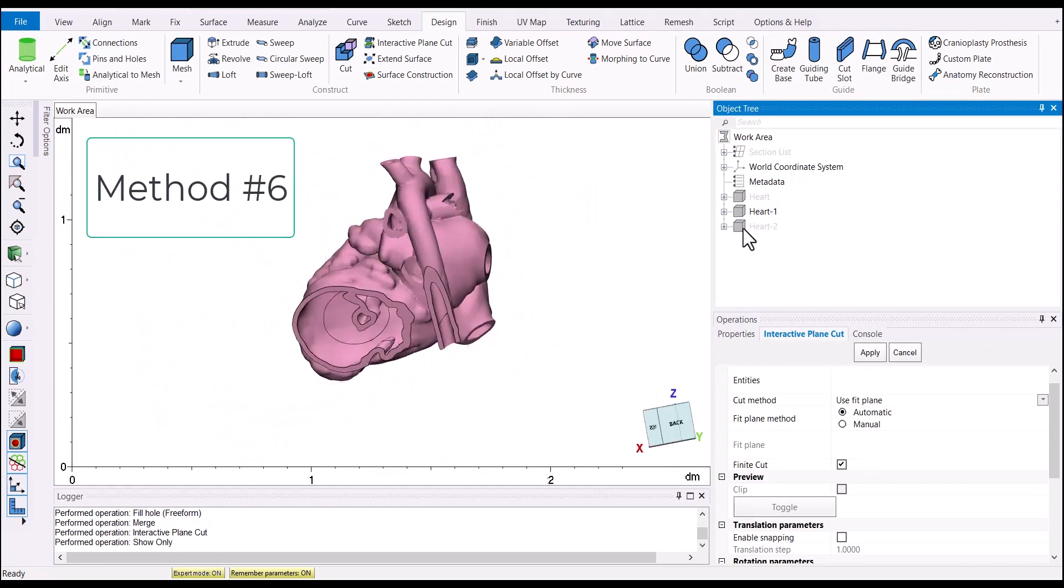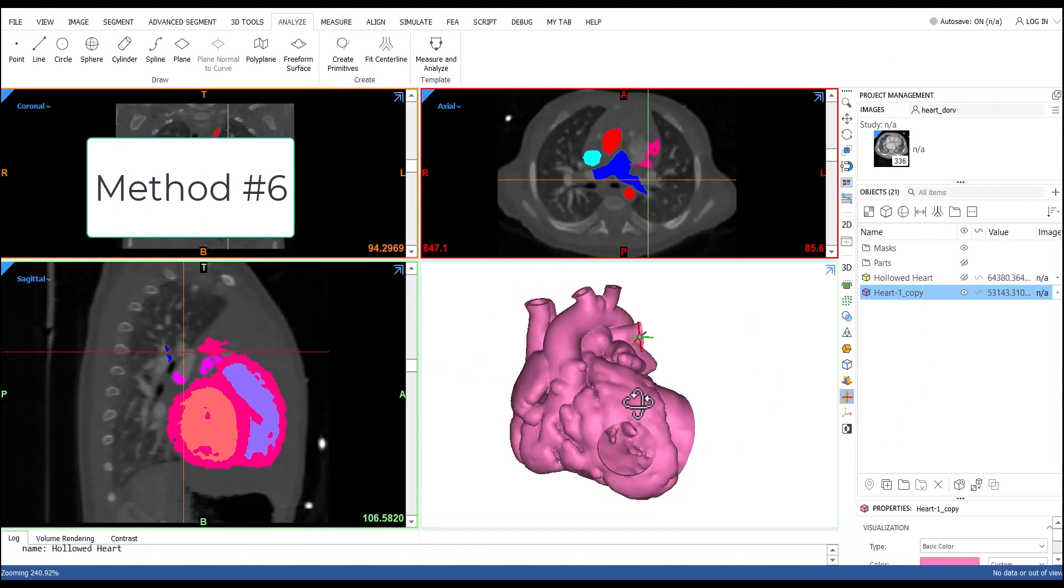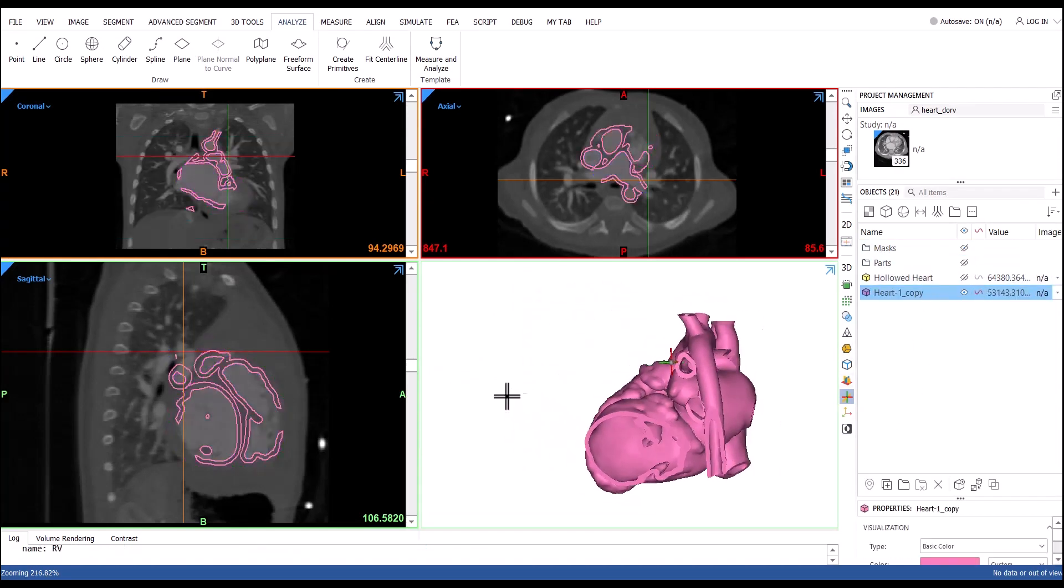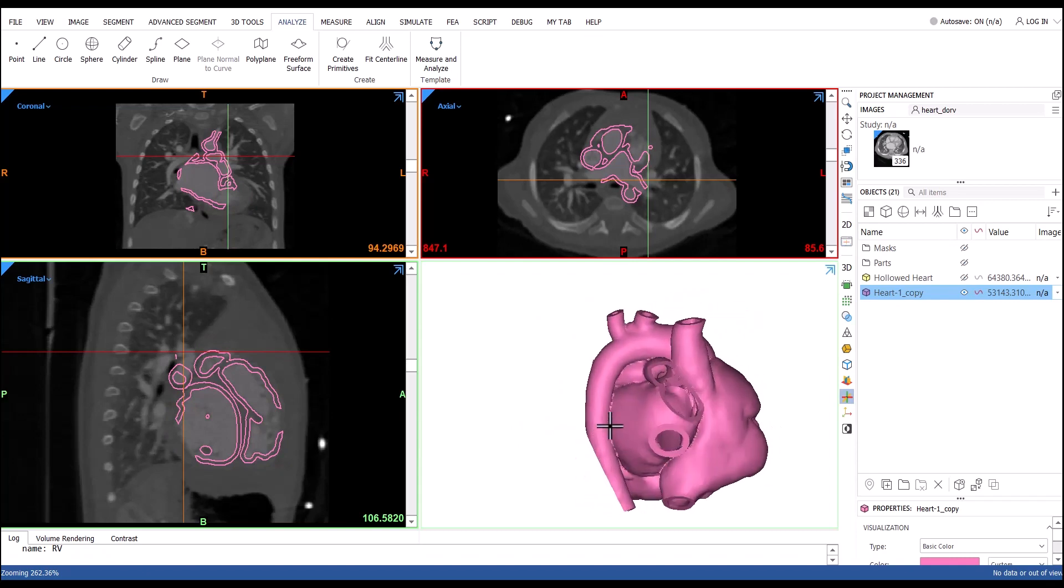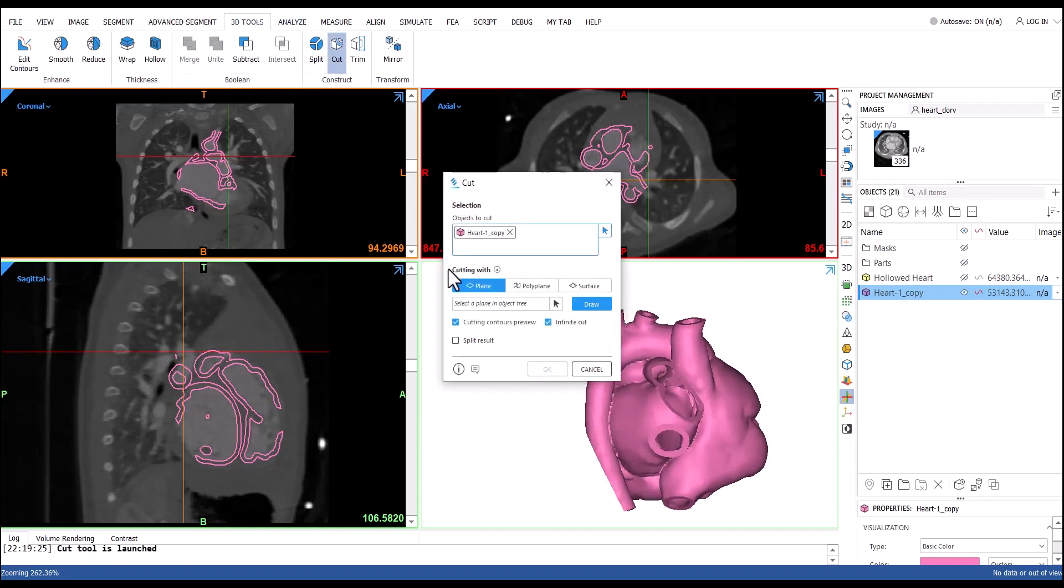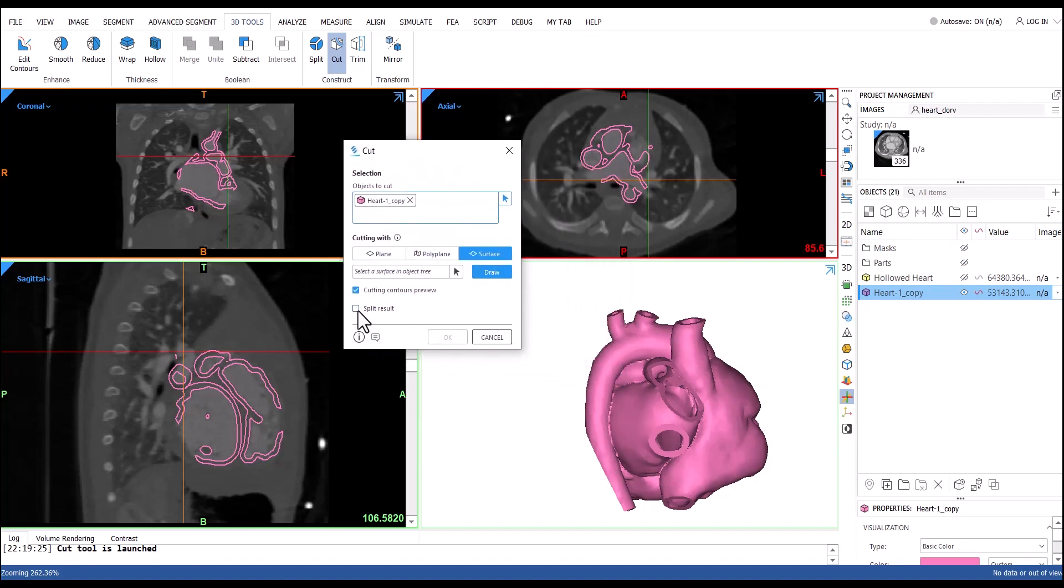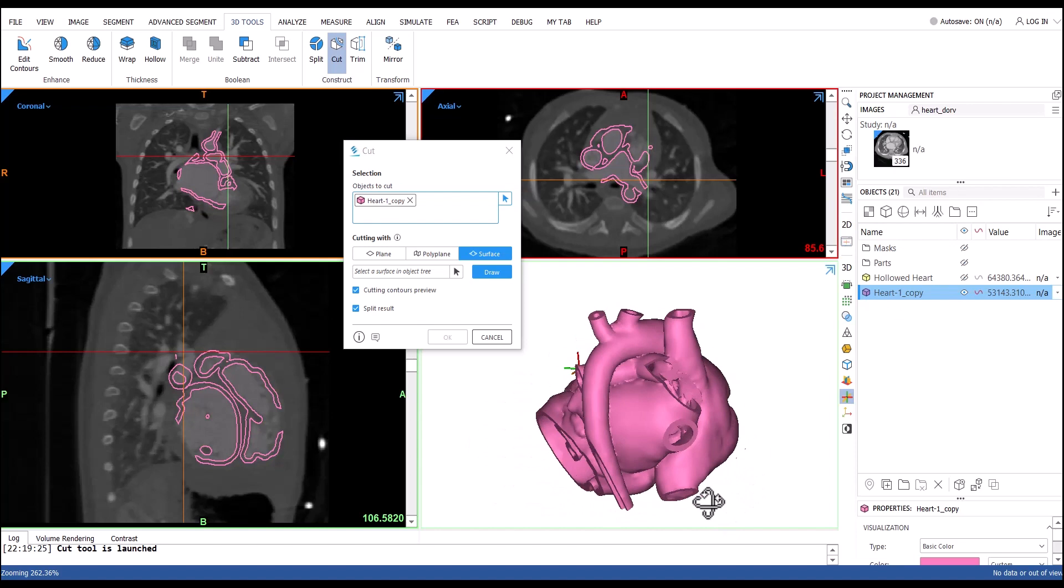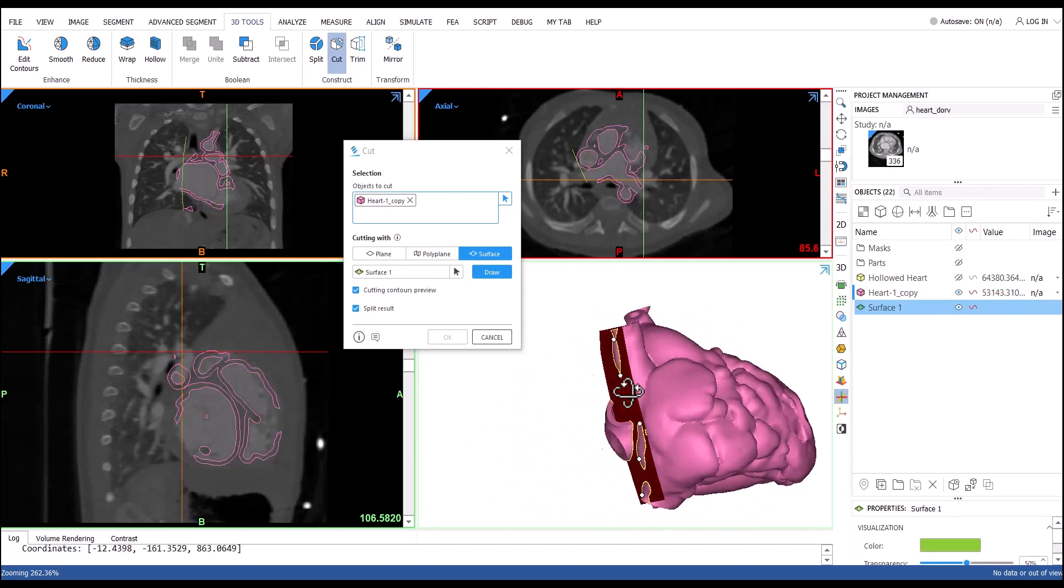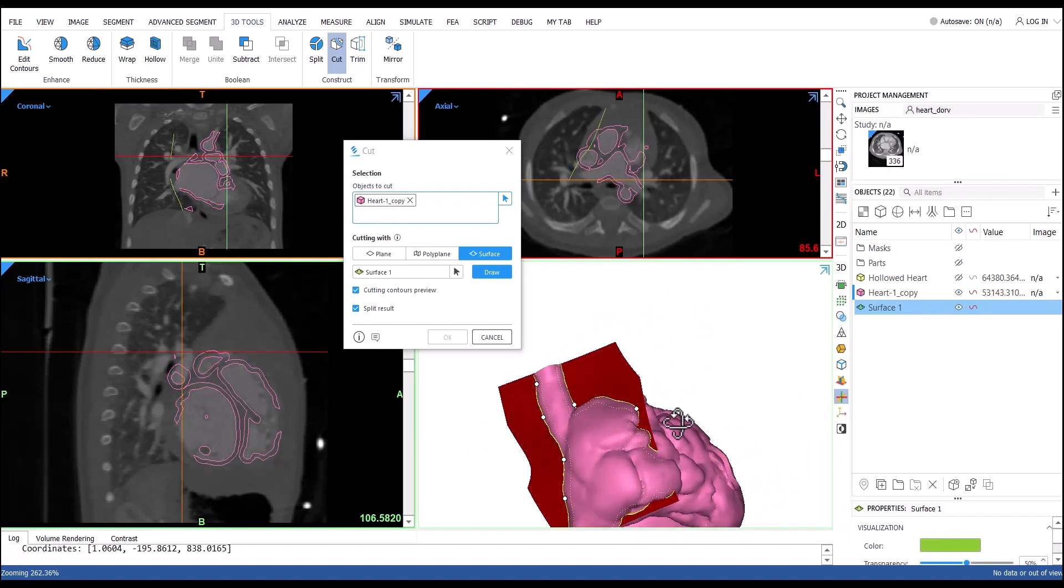Finally, method number six will show you how easy it is to make any organic surface or polyplane surface to make your cut. You can either click your points in the 3D window or you can click your points in the 2D images. Whichever makes the most sense to you.